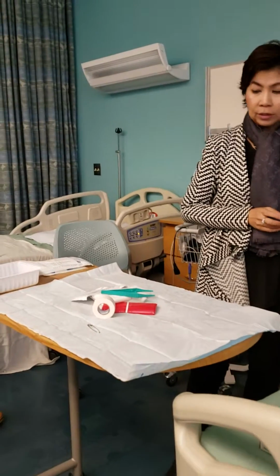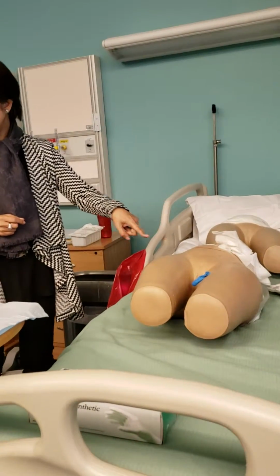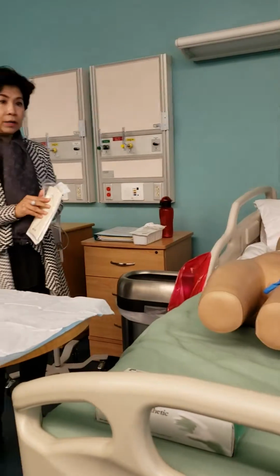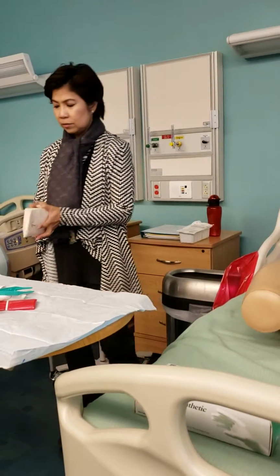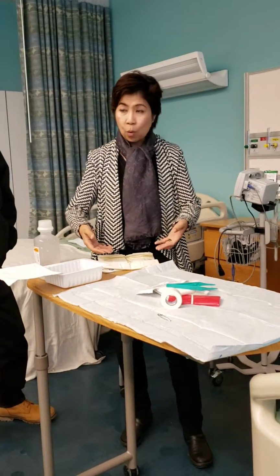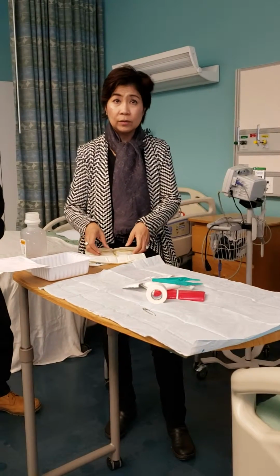So I've looked at the wound. Now I have to clean the wound, right? So the change tray doesn't have sterile gloves. So I get my sterile gloves. I can discard this, but I'm going to use that again. So make sure you're only touching the border, and make sure this one is not touching that one. Okay.